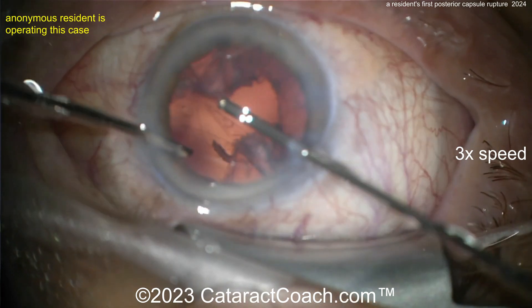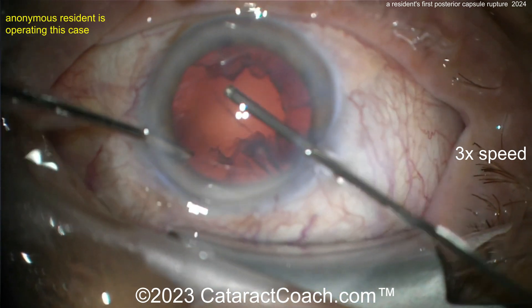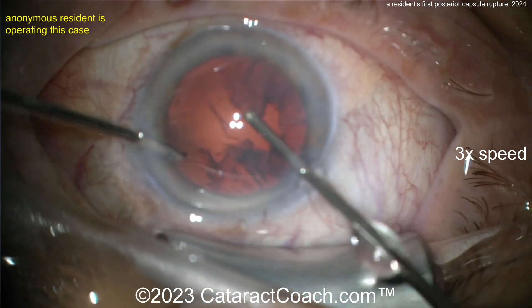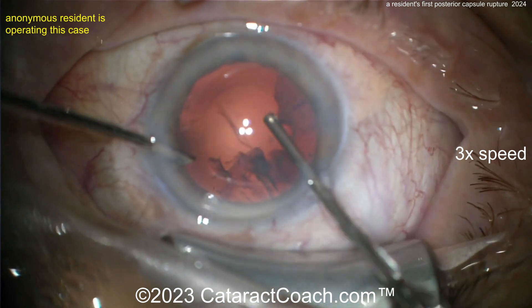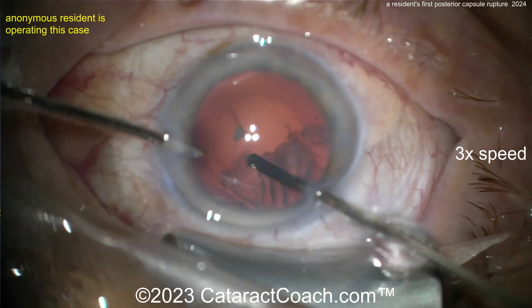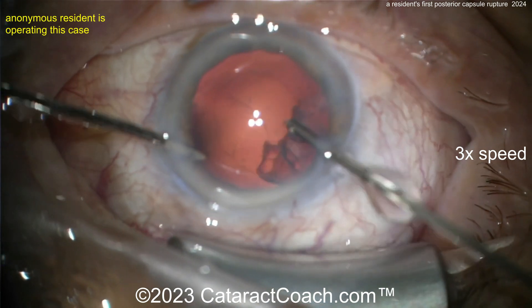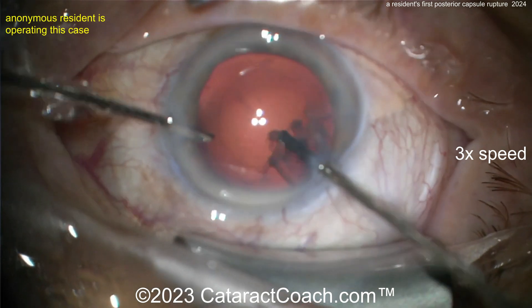The cardinal lesson from this video is that you need to watch the 25-part curriculum series on cataractcoach.com — there's one specifically about how to perform anterior vitrectomy. You need to watch it, know it, and own it.